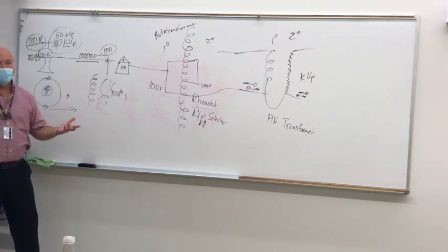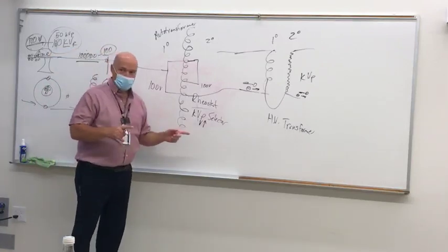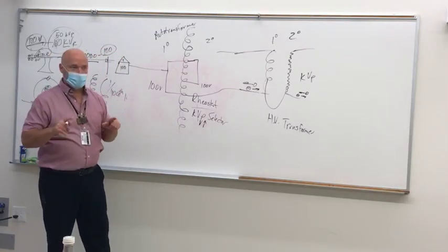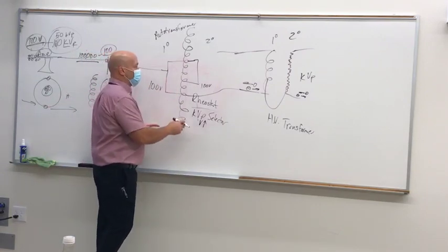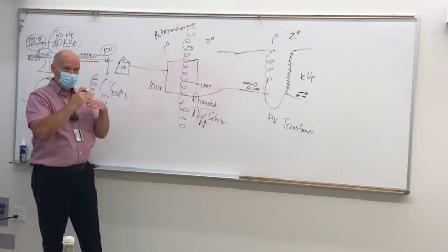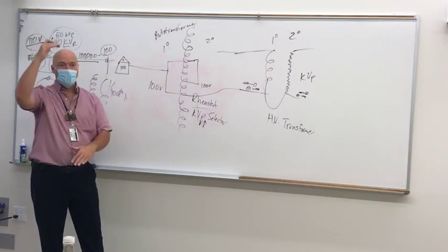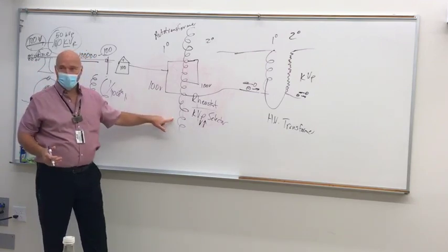For a finger maybe 50. Whenever you push those different exams, what you're actually doing is taking your autotransformer and either squeezing those contacts together for a finger or a hand, or spreading them out for a chest x-ray. What you're actually doing is selecting your kVp here.